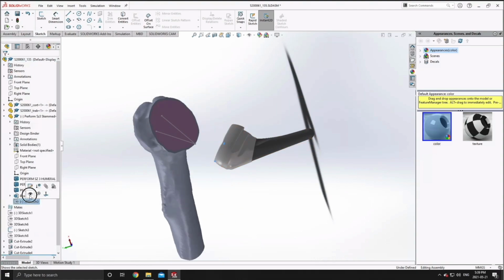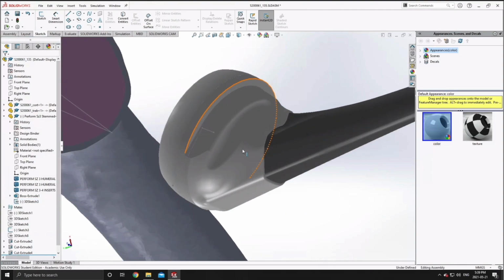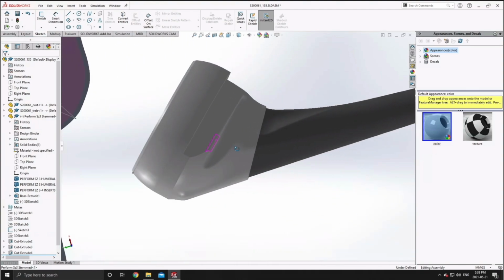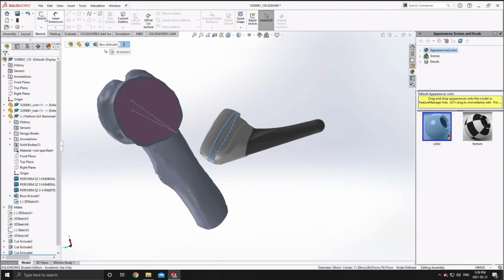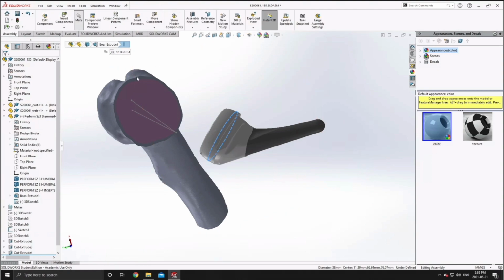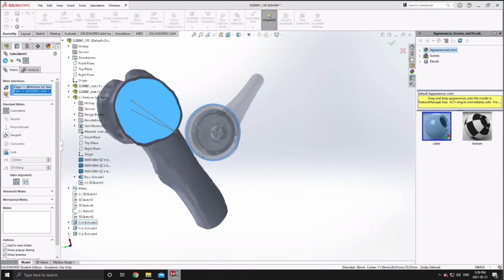So in this study here, I'm evaluating both this implant as well as a stemless variant and another stemmed variant. But in order to maintain consistency in implant positioning, you don't need to redo the cut planes or really any implant positioning after this step. All you need to do is maintain the same concentric orientation within the bounds of the trabecular bone and replace this implant with your other evaluation implants that you're going to be using.